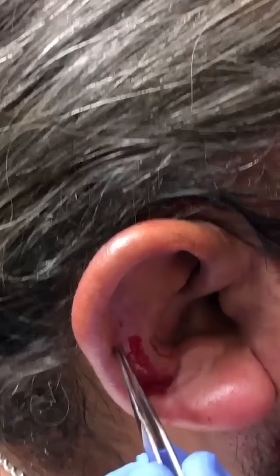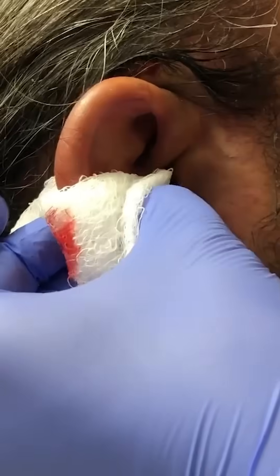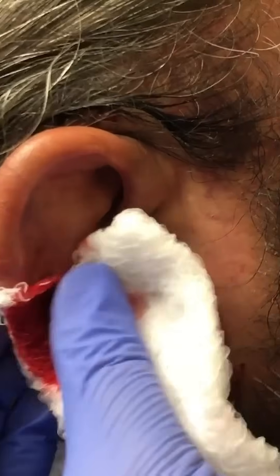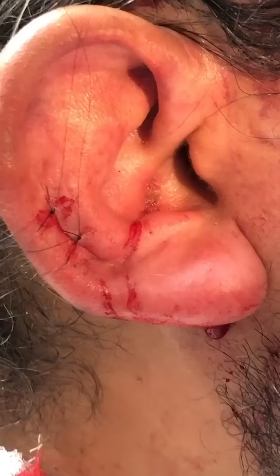For the first incision, follow the fold of the helix. Make a superficial incision so you don't cut deep into the cartilage. Gently deloculate and use some pressure to squeeze out all that blood. Flatten the ear back down to its normal shape. This is a standard closure with 6-0 nylon using simple interrupted sutures.